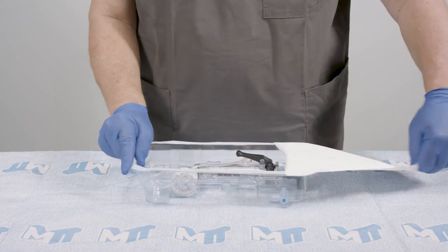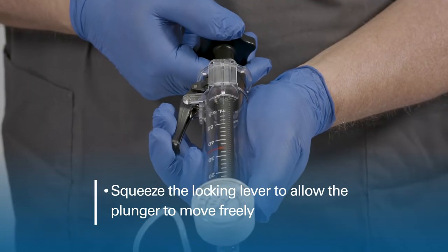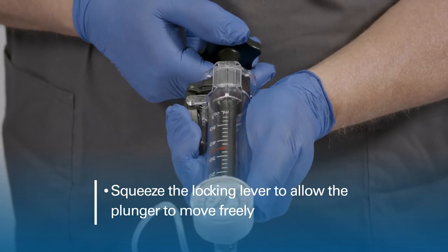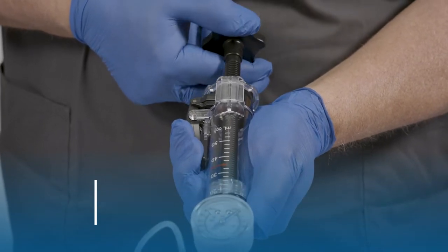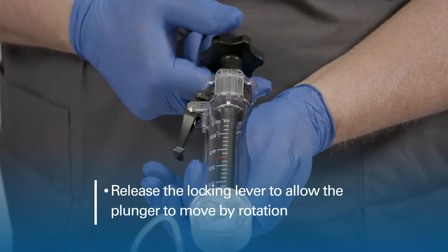To use, open the Tyvek lid and remove from the tray. Squeeze the locking lever to allow the plunger to move freely. Release the locking lever to allow the plunger to move by rotation.